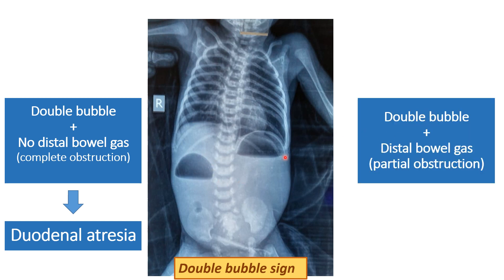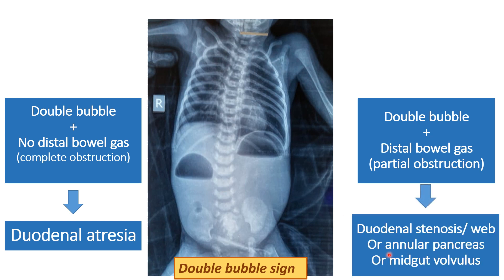Whenever the patient is having the characteristic double bubble sign but distal bowel gas is also visible — these two bubbles with air-fluid levels and some distal bowel gas — that means the patient is having partial obstruction, which is seen in duodenal stenosis, duodenal web, annular pancreas, or mid-gut volvulus.